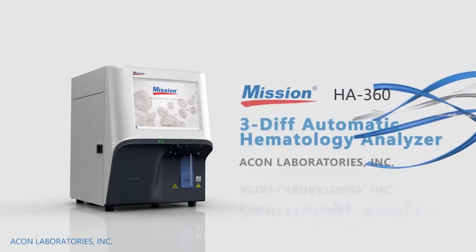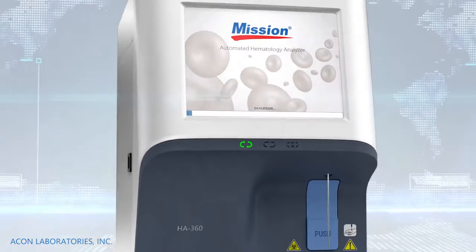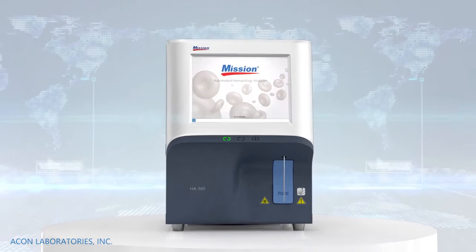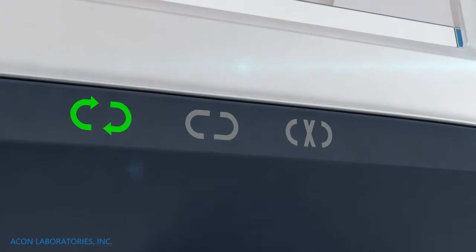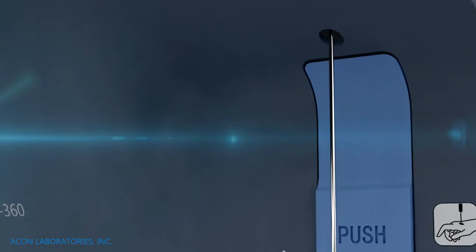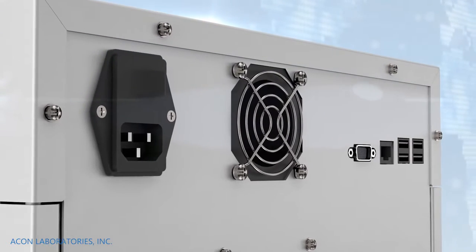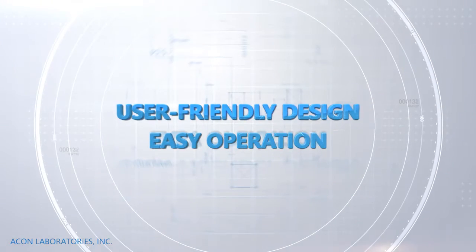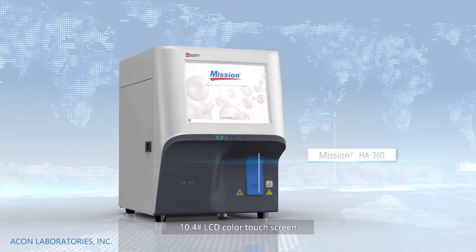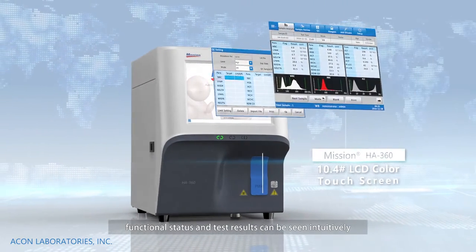Mission HA360 3Diff Automatic Hematology Analyzer. User-friendly design with easy operation. Features a 10.4-inch LCD color touchscreen where functional status and test results can be seen intuitively.